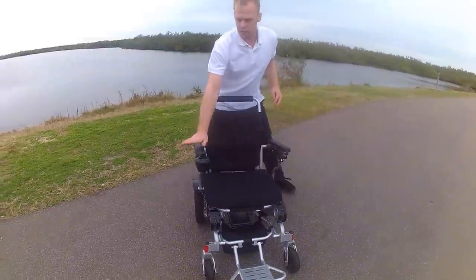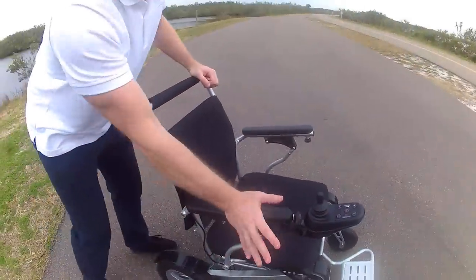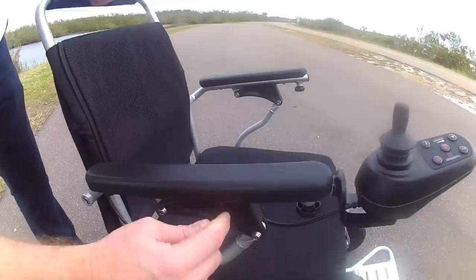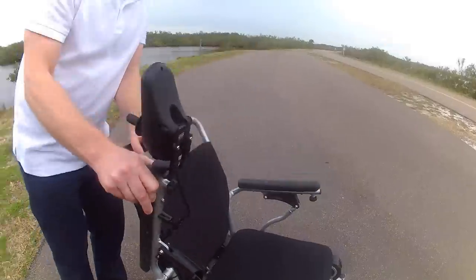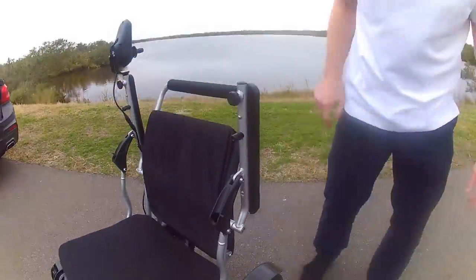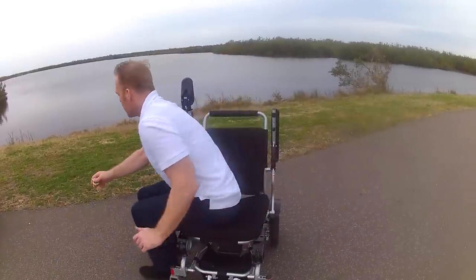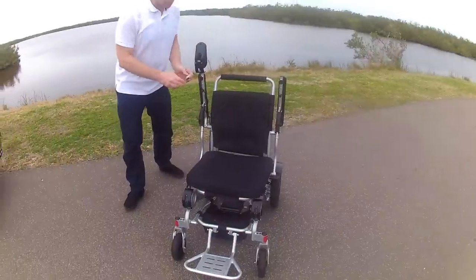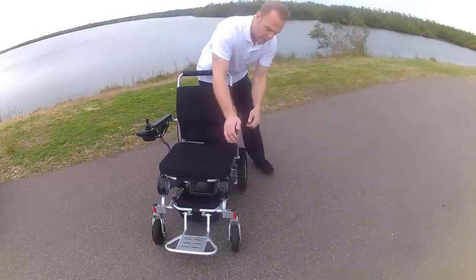If we take a look at the arms, they fold up very easily by switching one lever — locked down, one lever folds them up and they get completely out of the way. So if I wanted to do a side mount or a side dismount, it is very easy to do, and it is very easy to lock the arms back into place.